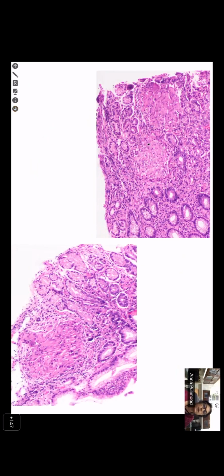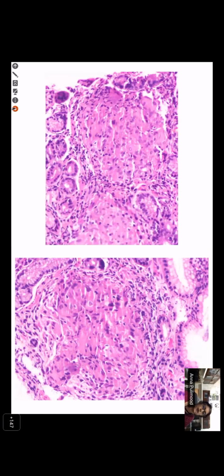So there are two granulomas close by. They're not yet confluent, but there are two granulomas. Here's another granuloma. Are these big or small? These are big, I can... Actually, they're small. They look big because I took it under high power. But they're actually small granulomas, less than a third the height of the mucosa, or half the height of the mucosa.